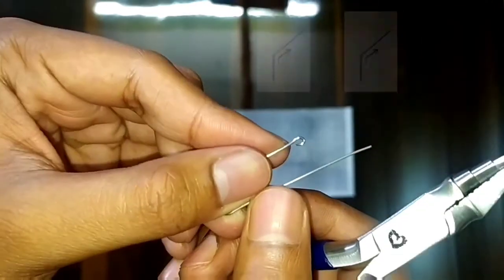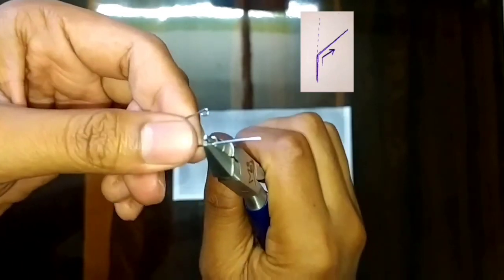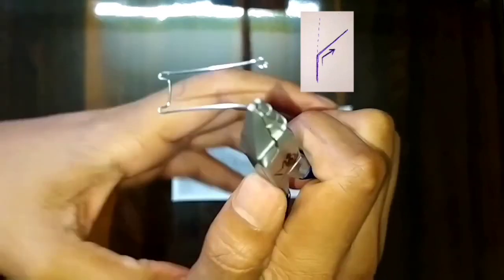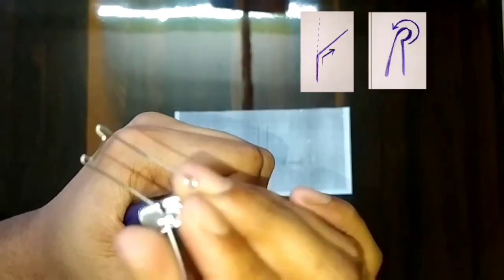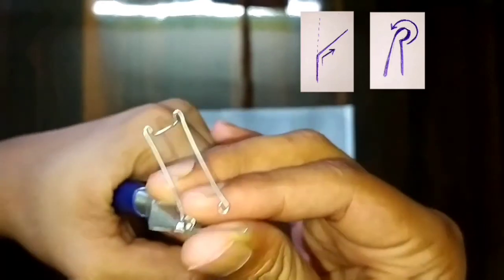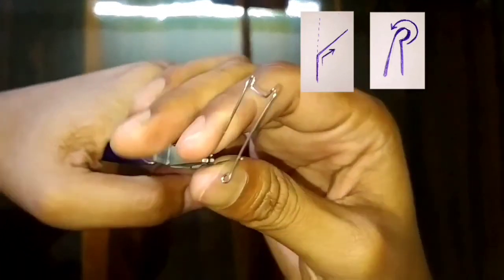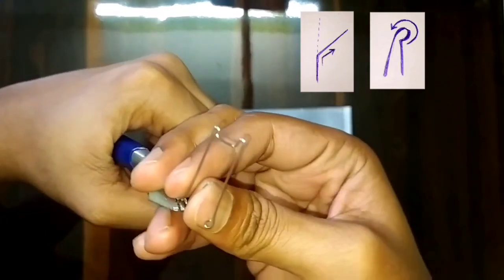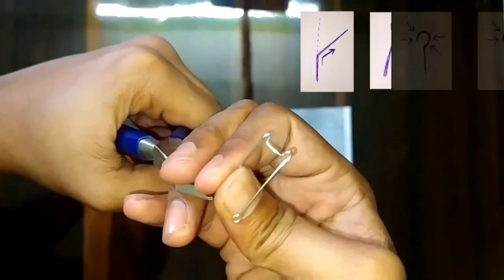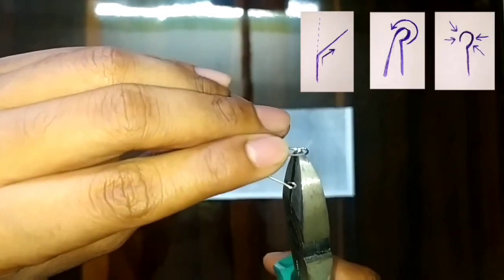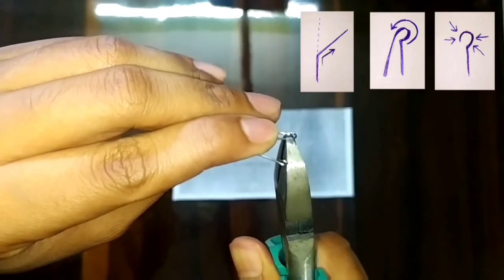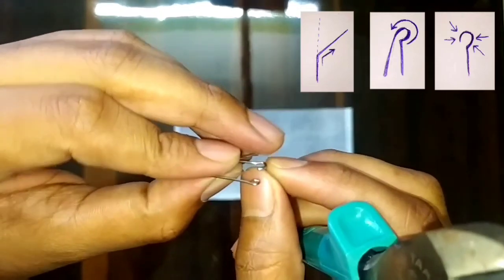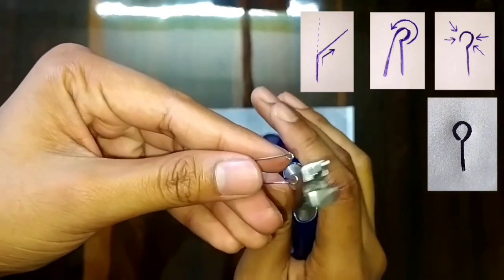Do similarly on the other side also. Follow simple steps: just bend the wire outside and roll it along the round beak, then cut the wire from the curvature and press it with the plier. You can see here the tag is formed.